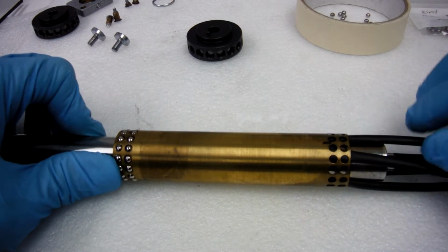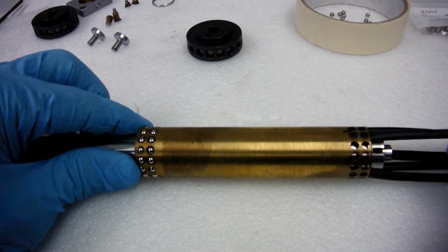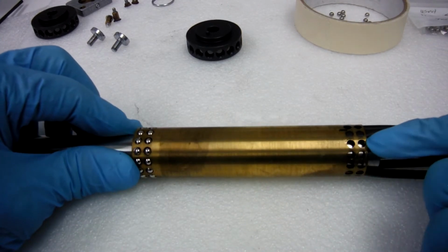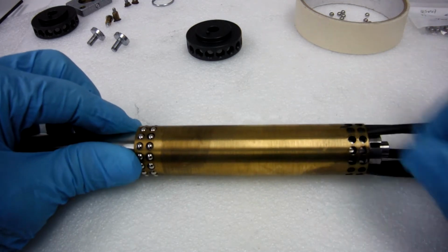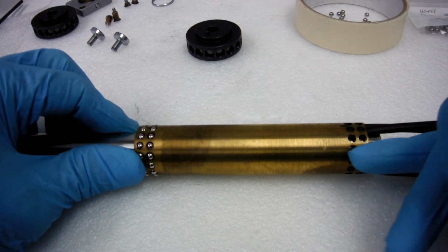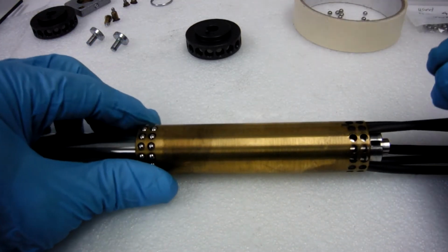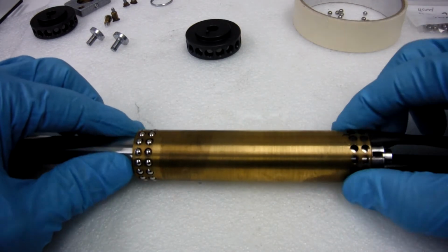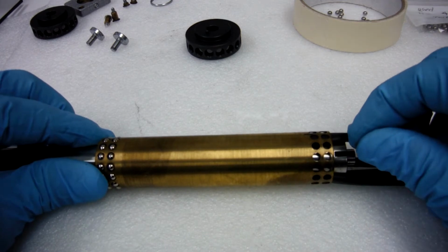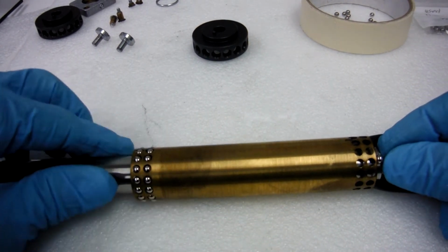bearing track round. And what we're going to do, we're going to slip a bearing in the first row, and then once it's in, we'll push it to the second row. And we'll do every other one till we go all the way around, and then we can fill in the gap on the first row. These are 4mm bearings. Line it up with our notch. Push.